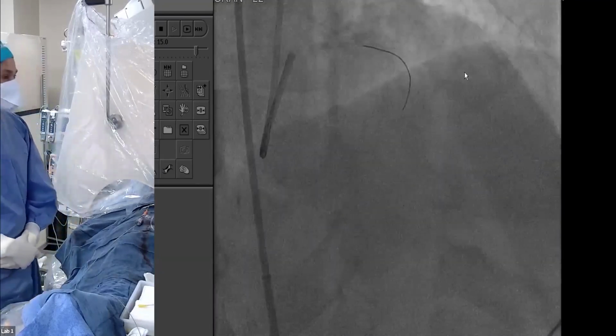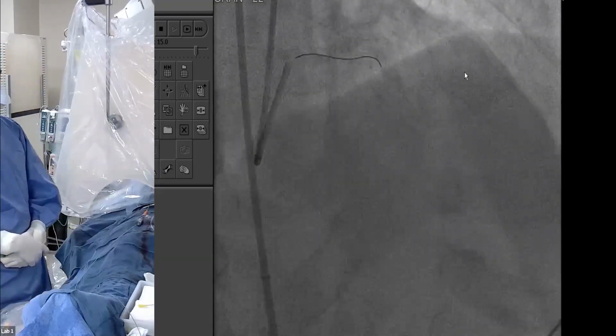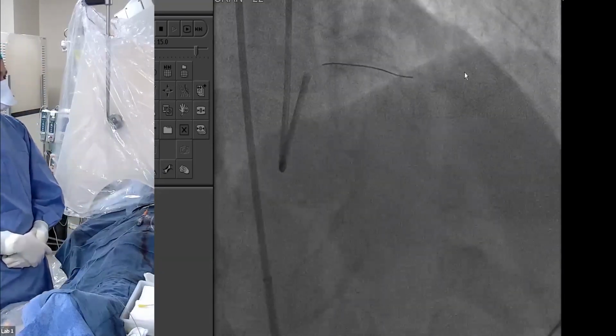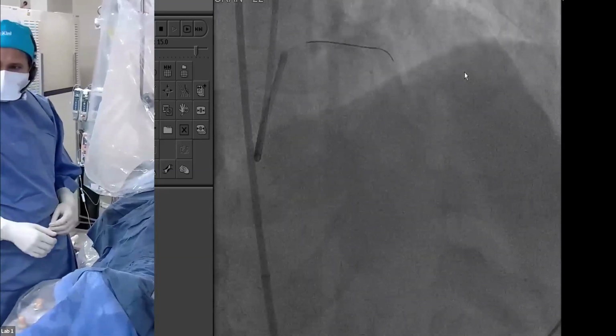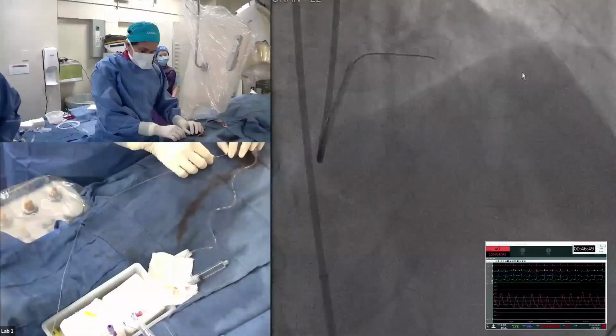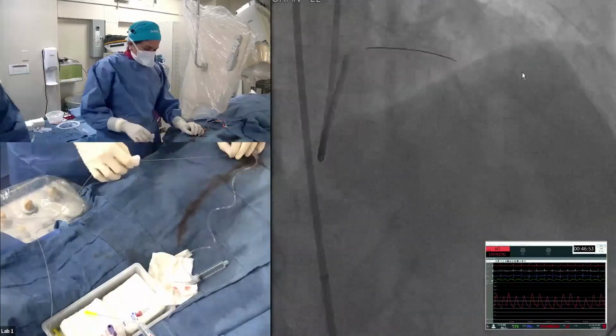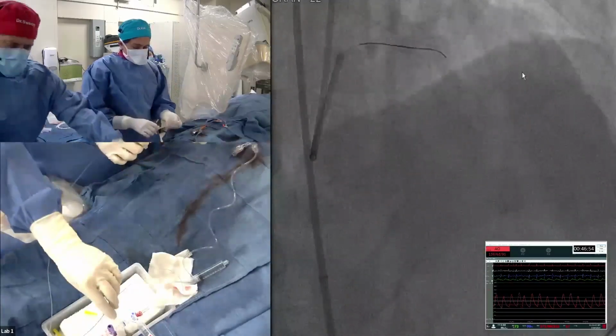Do you think about that before you even start imaging? You're seeing both of these major branches involved. It's really a 1-1-1, if you will. Is this just a two-stent strategy, so you're really going to have to wire both, probably image both, and think about that? You want to tell us that? Who wants to take that?